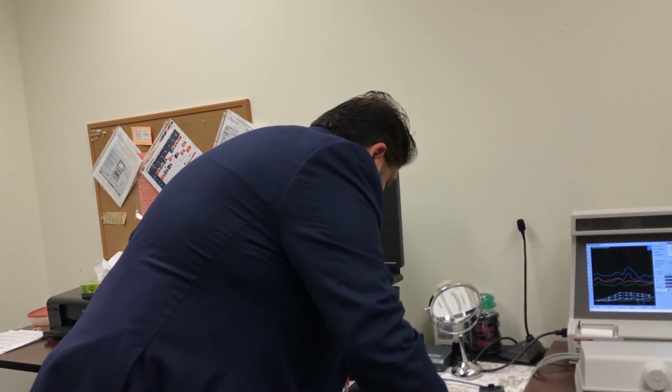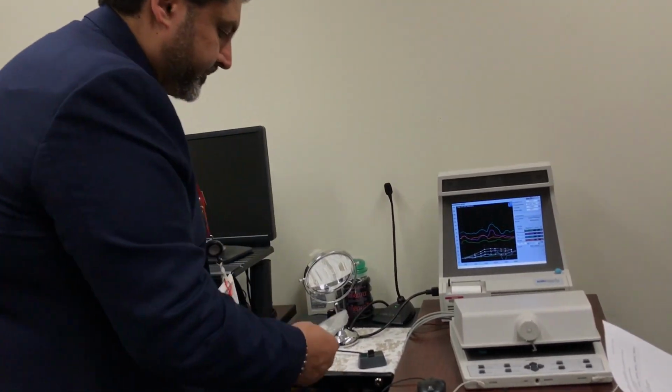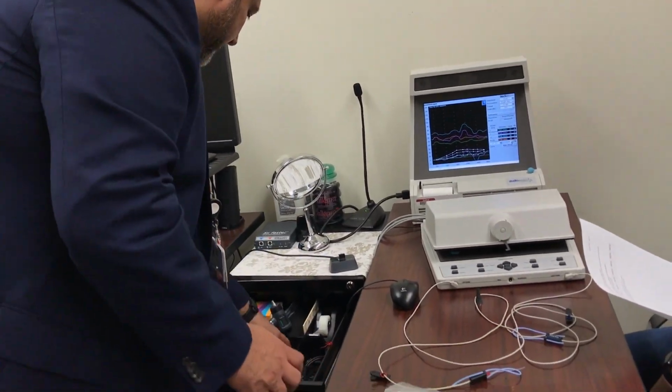So, I need, there should be a bag here. Here it is. That is not it.